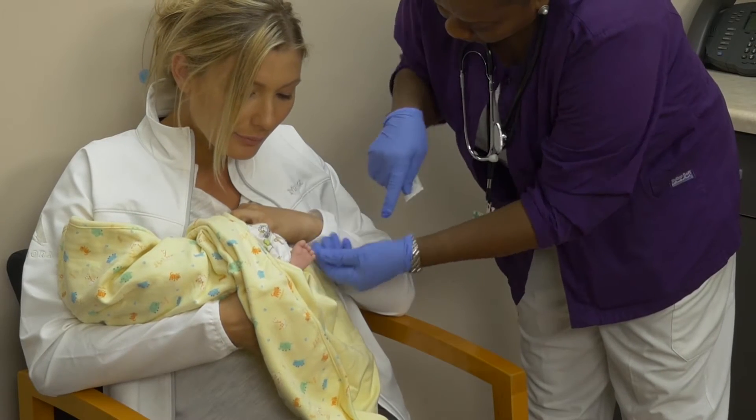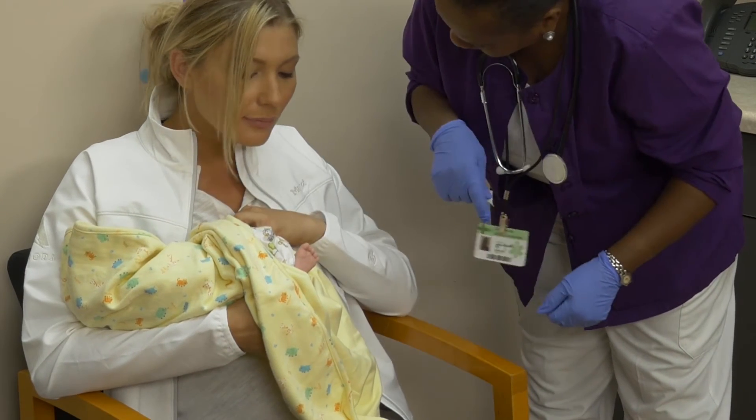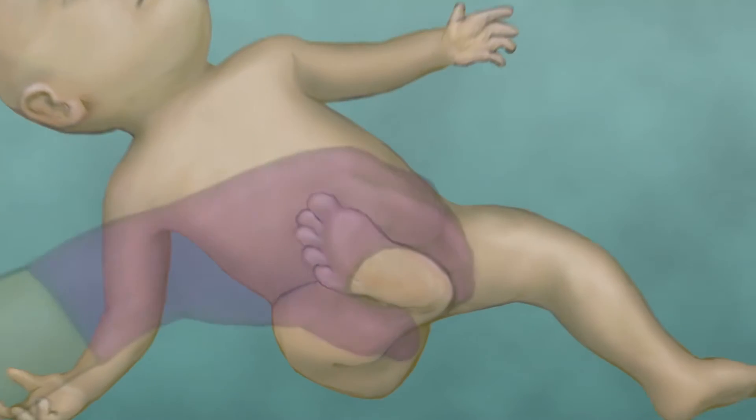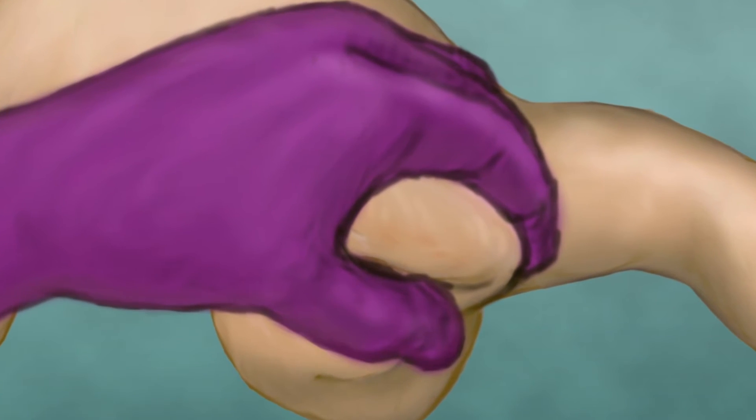Select and clean the appropriate site, allowing the alcohol to dry before making the puncture. Careful to avoid the cleansed area, grasp the infant's foot and, using a pediatric-sized lancet, make a puncture approximately one to two millimeters deep in the lateral or side portion of the infant's heel.